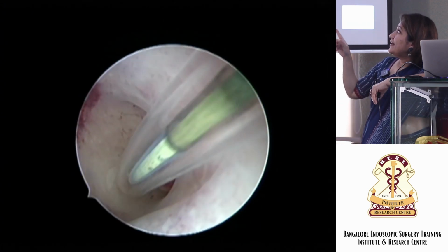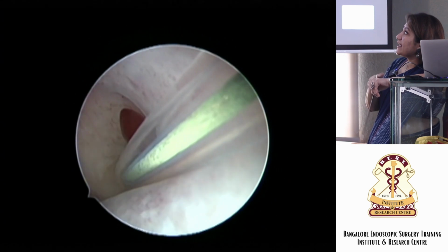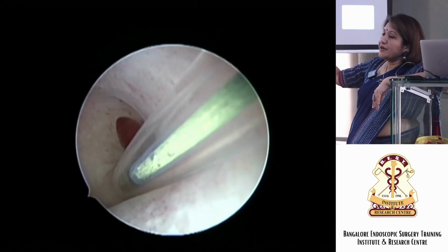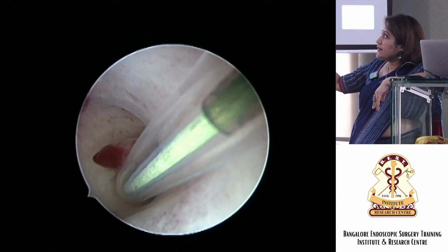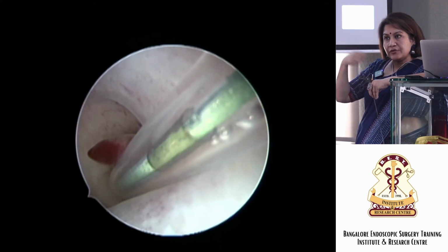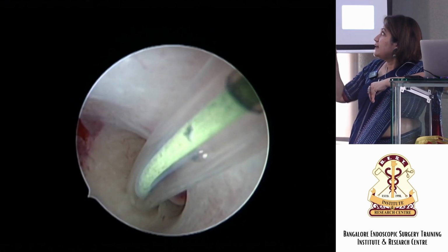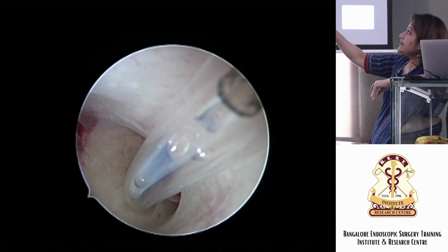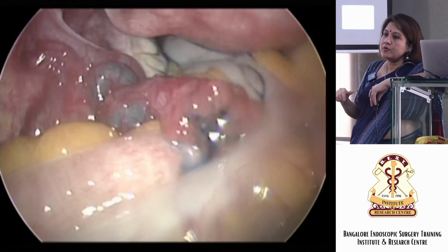Okay. So this is one cannulation, quite a few cannulations. This is Novi's catheter. It has an outer sheath and a guide wire, then an inner sheath. So you make the outer sheath go on to the ostia, then put the guide wire. So you cannulate the fallopian tube with the guide wire. Then comes the inner sheath, the black ring you can see. Then pull out the guide wire. Through the inner sheath, you put the dye.